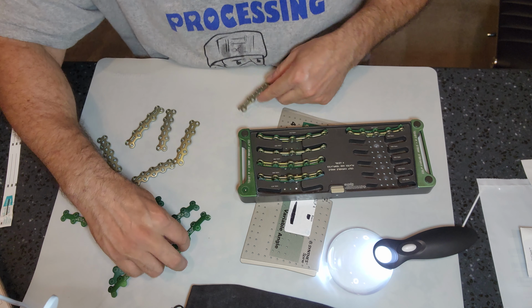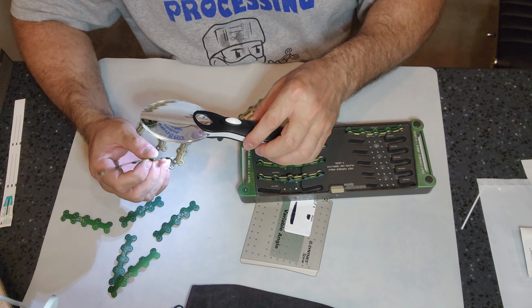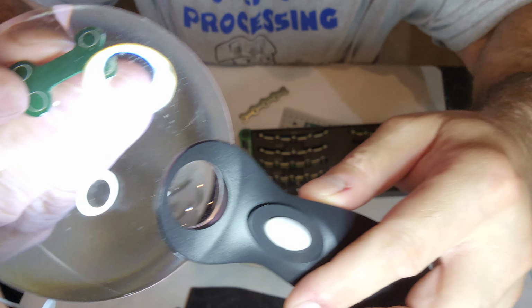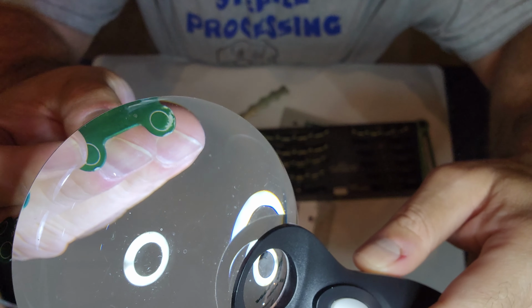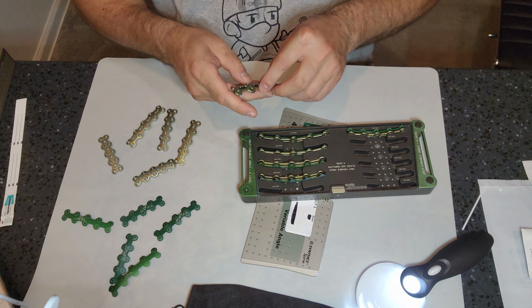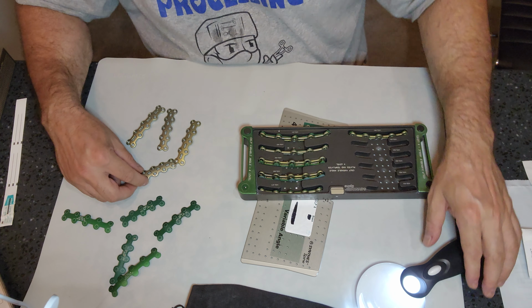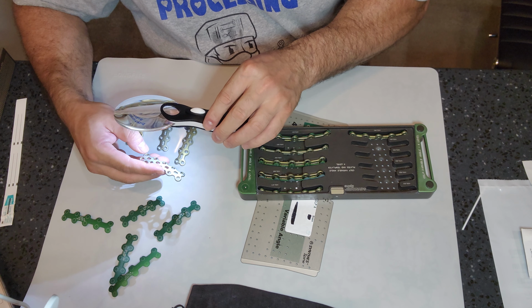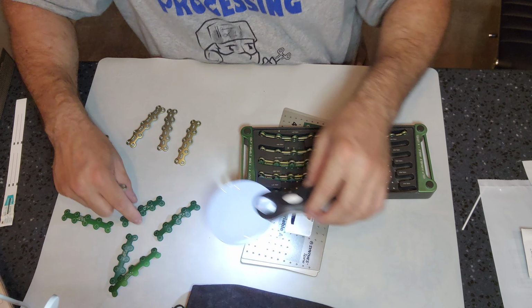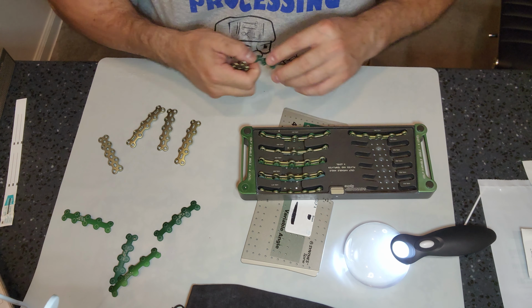So I'm looking for an 87 implant trial, or measurement. I can see right here that there's a little damage to this trial, right there in the corner. This probably needs to be sent out, right? But again, we're going to imagine that this is not the case. We're going to continue inspecting. 181, clean.